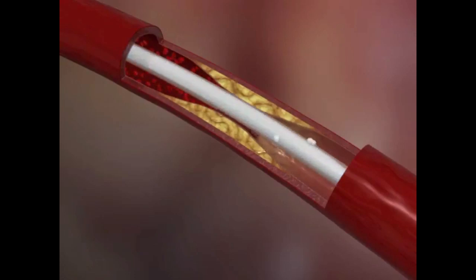The contrast medium is then injected through the distal holes to view the distal vessel. Simultaneous injection through the guiding catheter makes it possible to view the length of the lesion. As the Amicath continues through the occlusion, anti-aggregants and other drugs can be injected locally through the distal holes, reaching the distal microcirculation and reducing the risk of lesion by reperfusion.